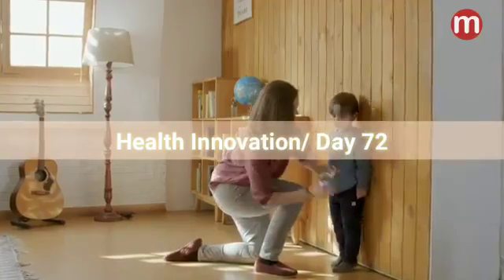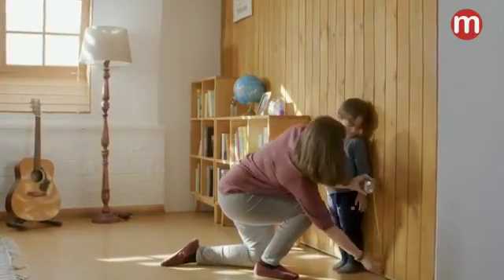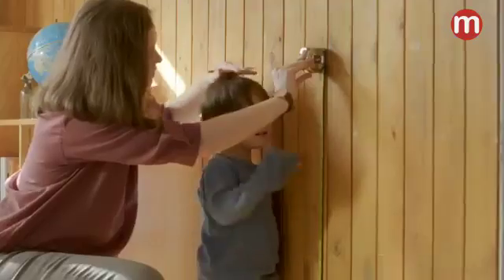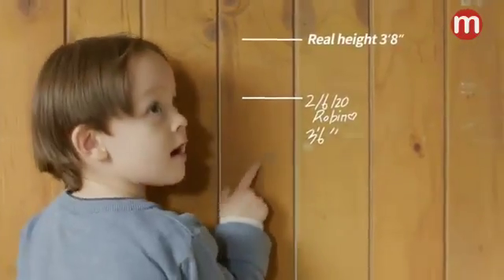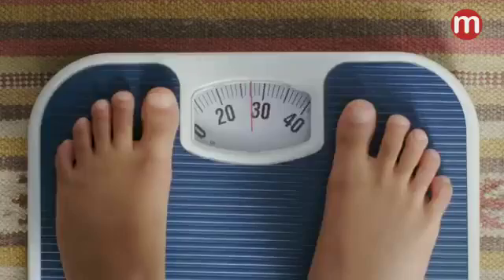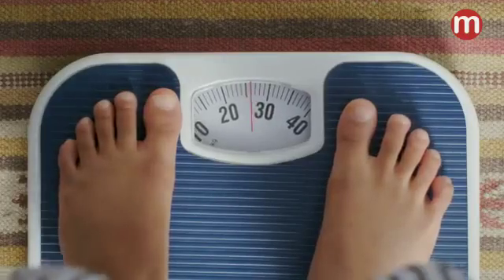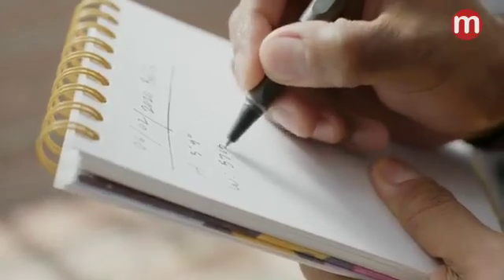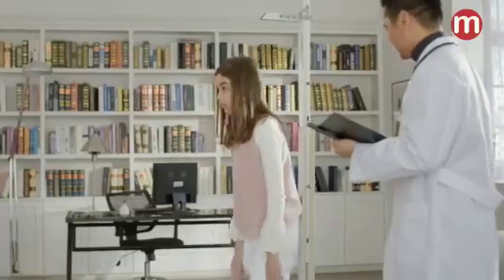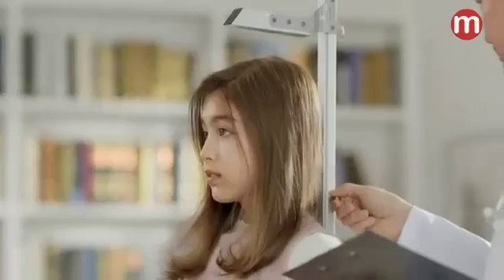How do you measure your child's height and weight at home? It must be inconvenient, inaccurate, and quite hassling to record the data. So you end up visiting the doctors for more accurate measurements.